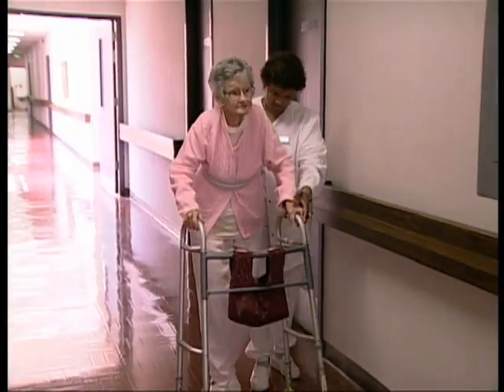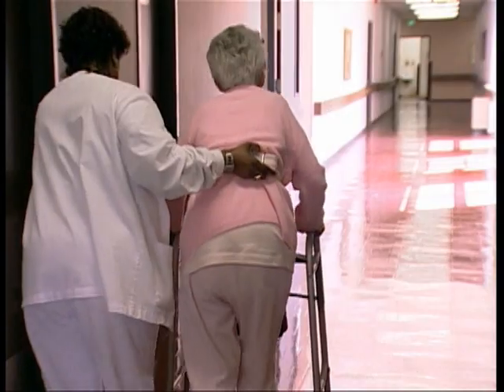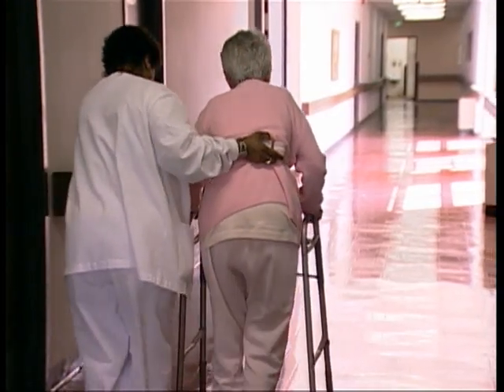Using the gait belt gives me the confidence that the resident is going to be safe, because I'm holding on to the resident. And then you're guiding the resident in the way that you want them to go, and that supports them. That gives them a good feeling about themselves to know that you're there, and by the feeling of the belt, they know that you're with them.